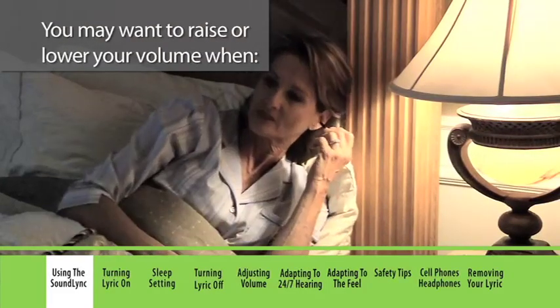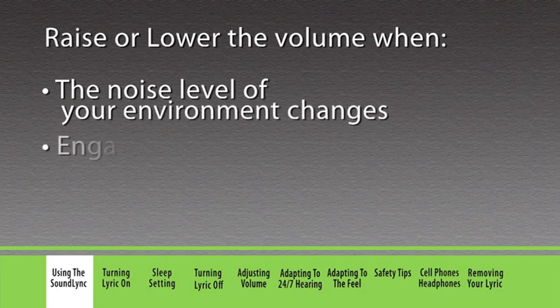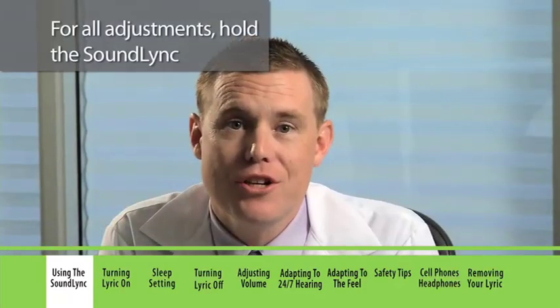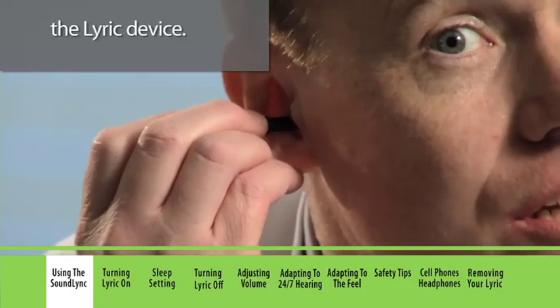You may want to raise or lower your volume when the noise level of your environment changes, when engaging in certain types of activities, going to sleep, or after waking up. For all adjustments, hold the SoundLink just inside the ear canal but not touching the Lyric device.